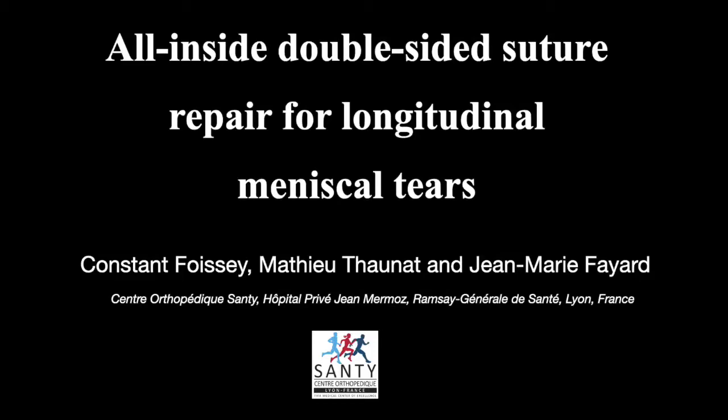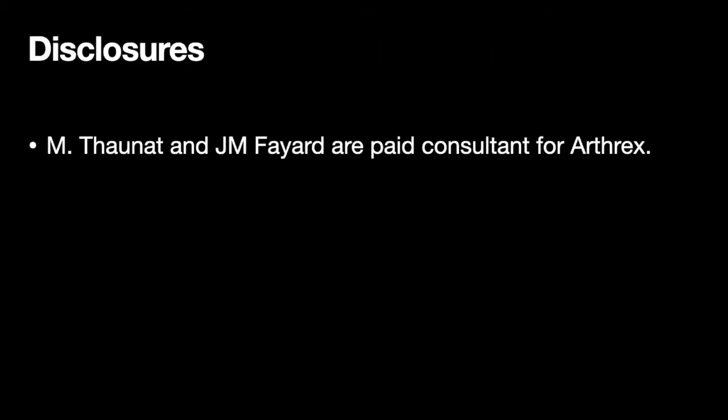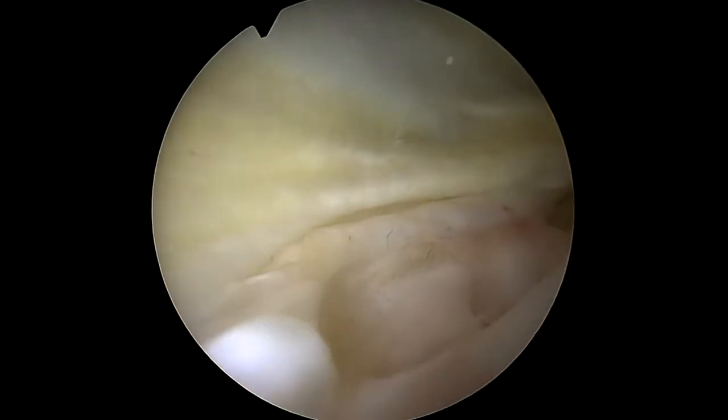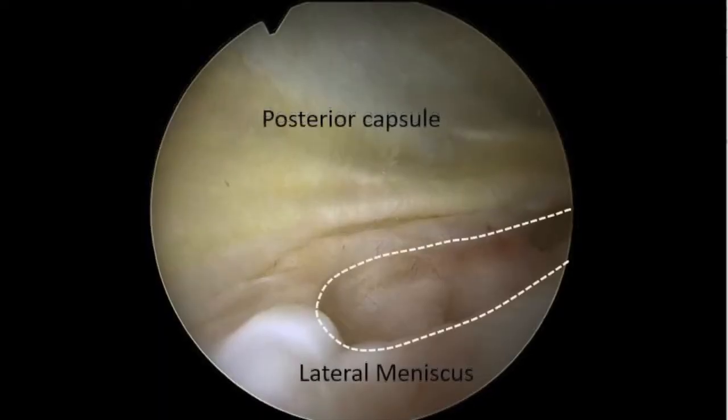In this video we present different examples of meniscal repair using a double-sided technique. Exploration of the lateral meniscus reveals a longitudinal lesion located at the limit of the posterior horn and extending towards the mid-body. By placing the scope at the periphery we can observe this lesion located at the menisco-capsular junction.